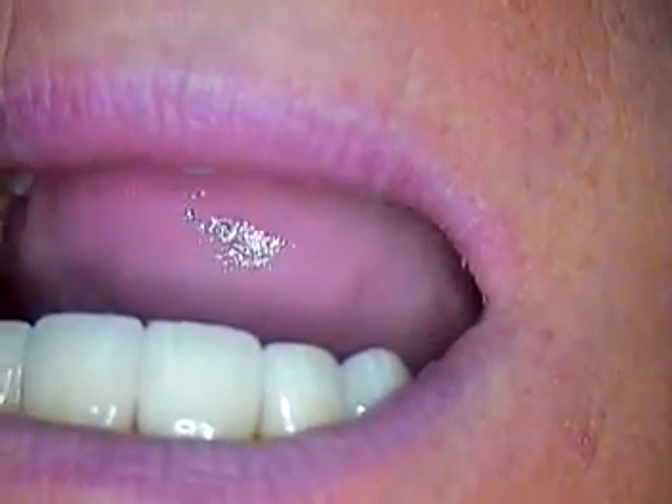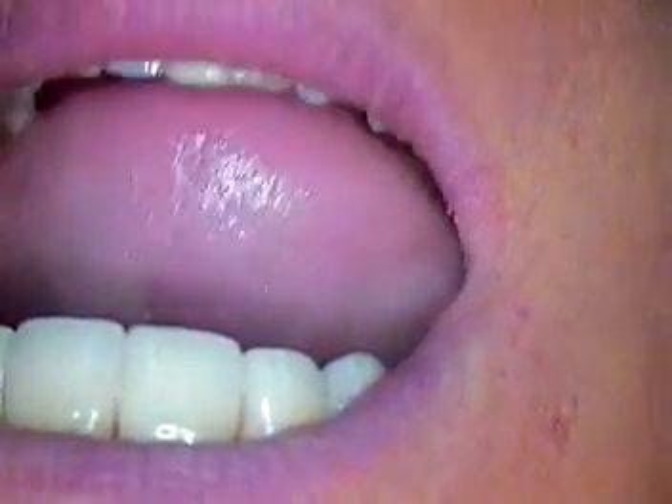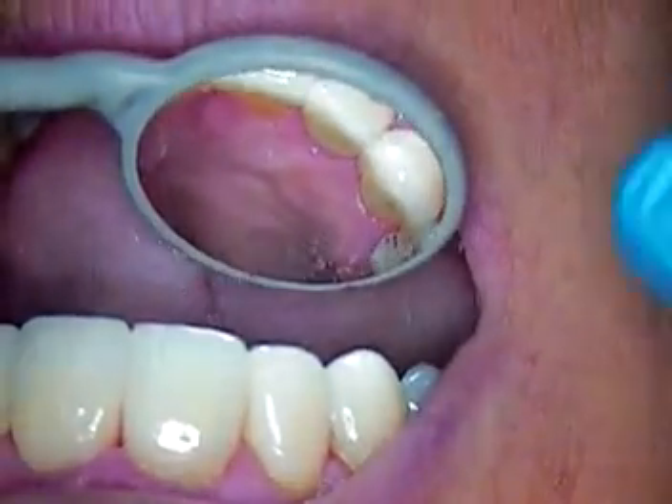Hello again, this is Dr. Jerry Cuomo. We're going to walk through the three-quarter crown veneer case now that it's been cemented permanently.